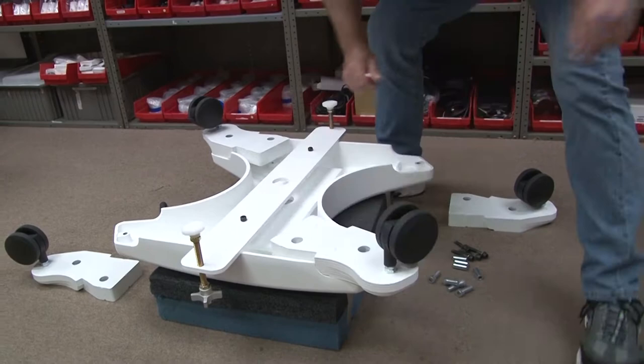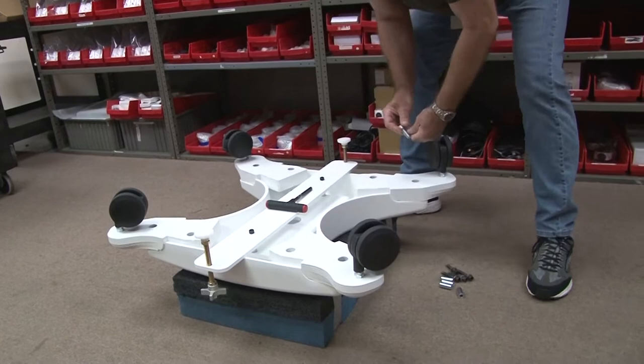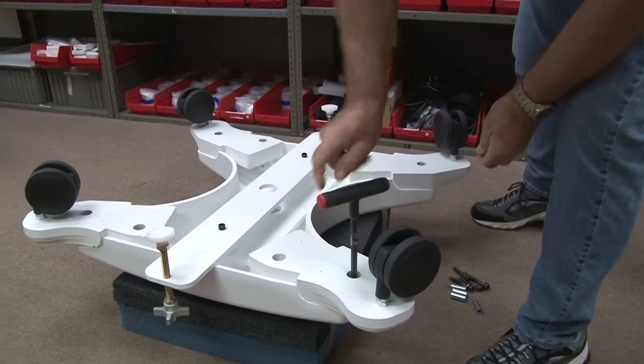It's best to do opposite corners first, so don't flip-flop. Start the large bolt first, just a couple of threads, just to hold them in place.